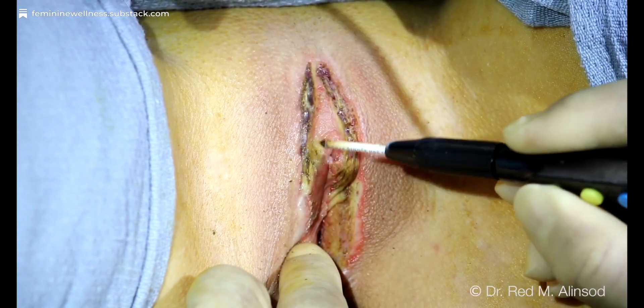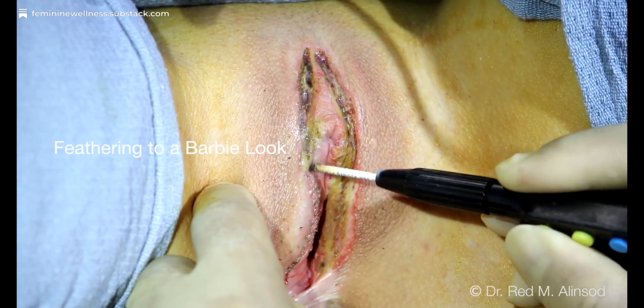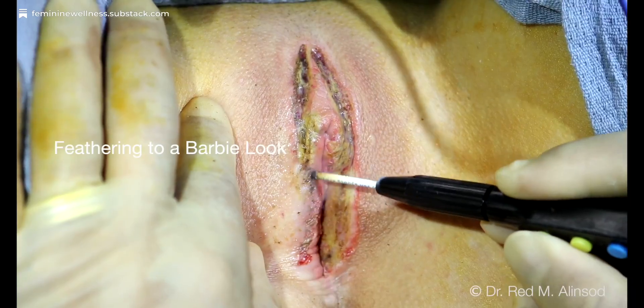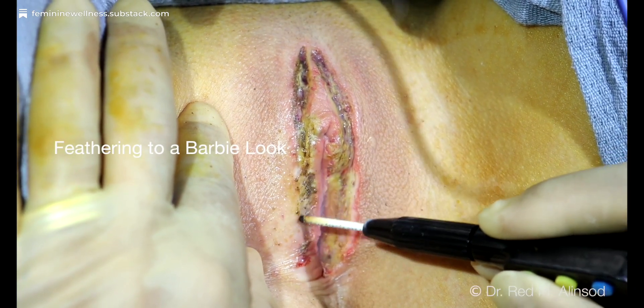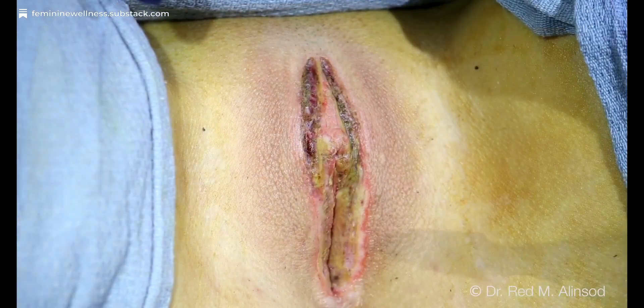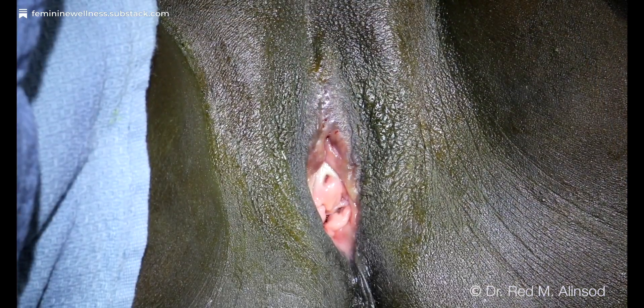This will take about six weeks to heal — it'll have a white discharge. I'm feathering this area; she wants a Barbie look now where there's minimal labia and a smooth edge. So I'm going to smooth out the prior incision lines from her prior labiaplasty. This is how it looks after — all those areas will have a discharge for about six weeks.